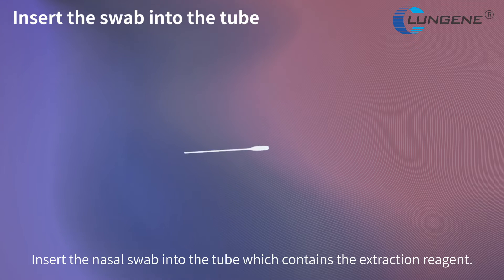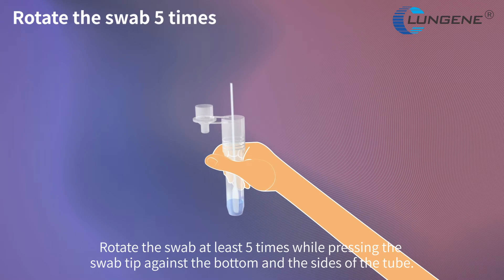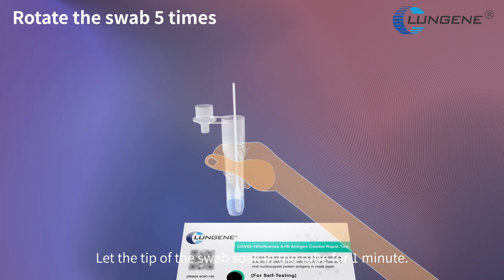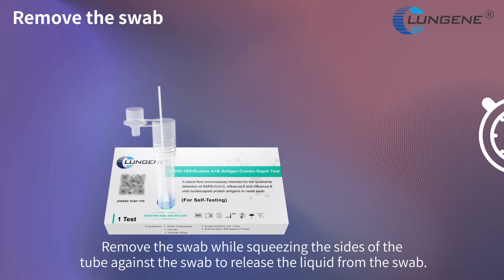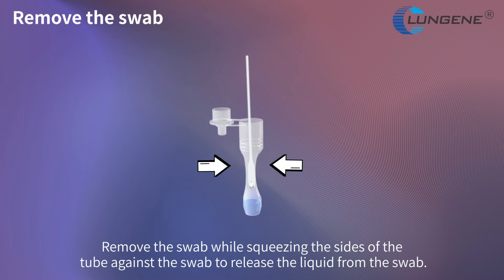Insert the nasal swab into the tube which contains the extraction reagent. Rotate the swab at least 5 times while pressing the swab tip against the bottom and the sides of the tube. Let the tip of the swab soak in the tube for 1 minute.